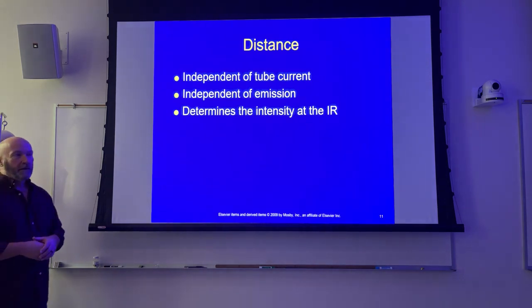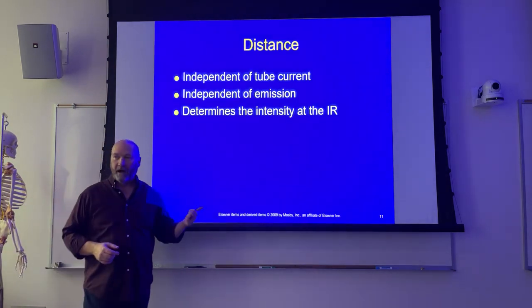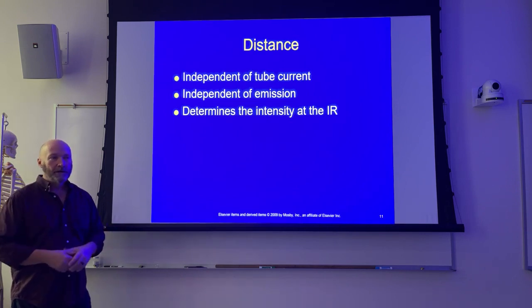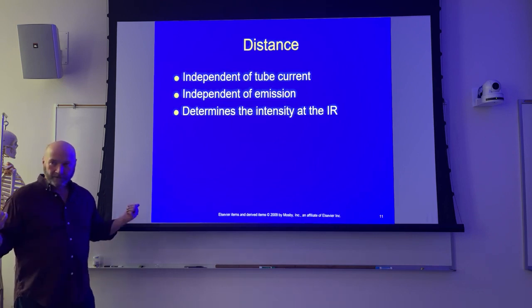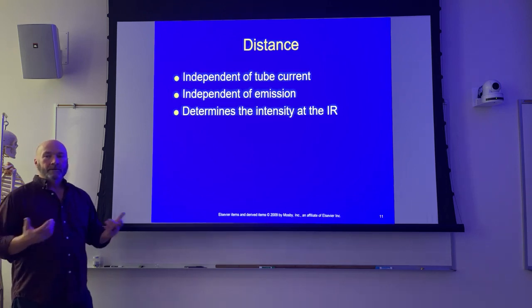All that stuff is set with that one little button that says AC joints. So, again, if you're working in the department, you're probably not going to be setting your technique. You're going to push a button and it sets all that stuff for you. So if you make your exposure at 40 inches, and you back up to 72 inches, now what's going to happen?